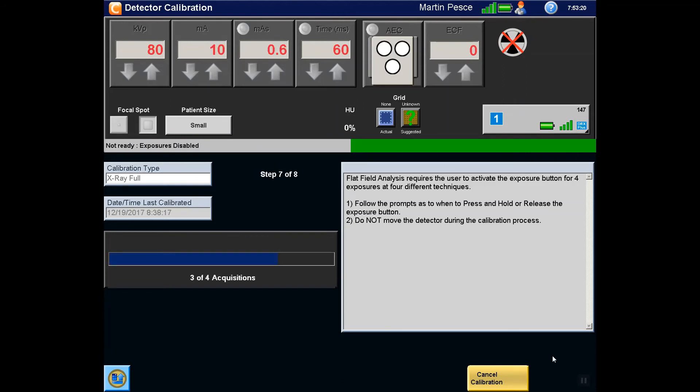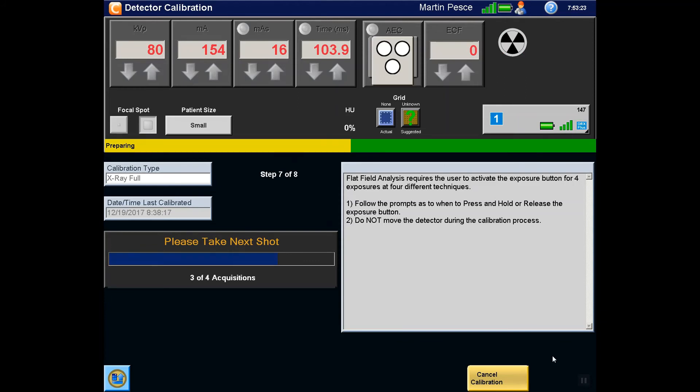Step 8 requires no interaction by the user. During this step, the system is performing its final analysis.